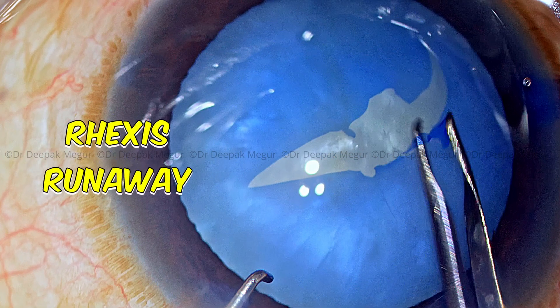The one on the left, which has got multiple fluid pockets, is less likely to have rhexis complications — we are more likely to get a successful rhexis. Whereas the latter one, which does not have fluid pockets and where the entire lens is swollen, is the one at higher risk of the rhexis running away.